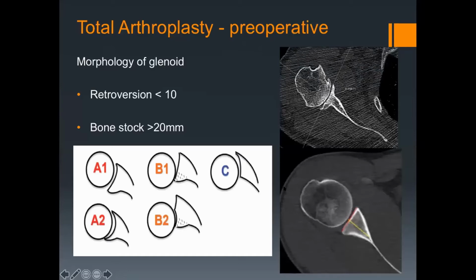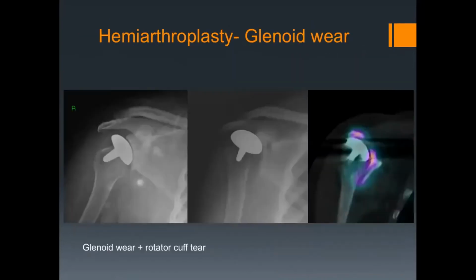So moving on to total shoulder arthroplasty, so there are a number of important... Chris, sorry, just on that. Yeah. That's a Copeland hemiarthroplasty. There used to be loads of them out there. There'll be progressively less and less. If you see a half shoulder replacement done at our place, it'll be a ceramic head because the wear properties are less.